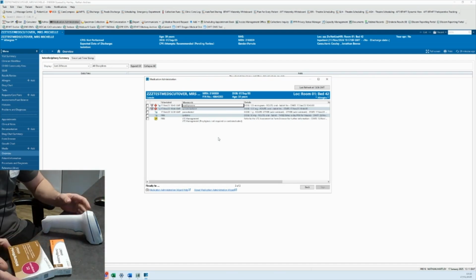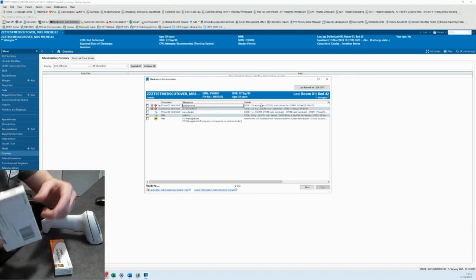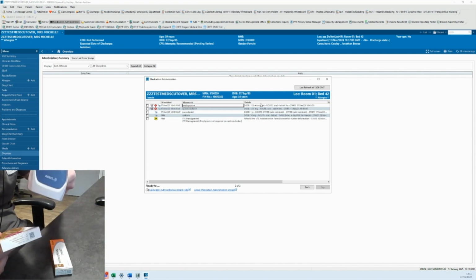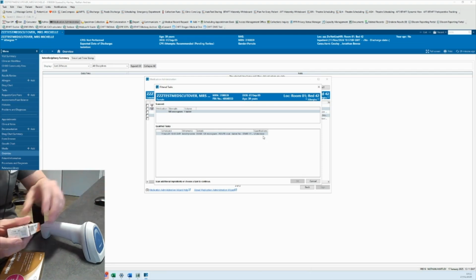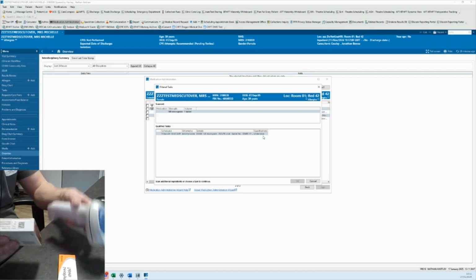I'll use the example of levothyroxine. In my patient's example, I have a 125 microgram dose to deliver. As I said, if these were covered up and we just couldn't access these or they were damaged, I would then first scan my 100 microgram box, which is this one. A pop-up tab will appear in the qualified task stating that this is an underdose at 100 micrograms. I will then scan the 2D barcode on my 25 microgram box.